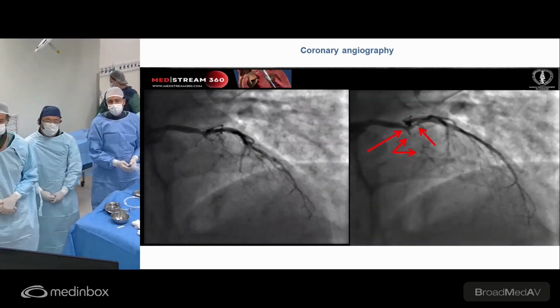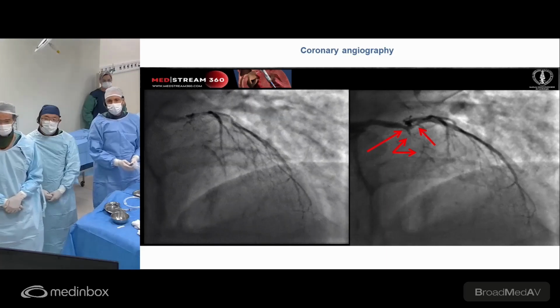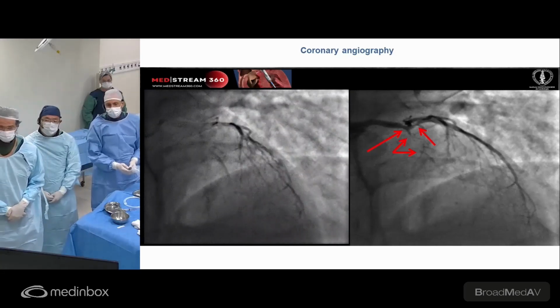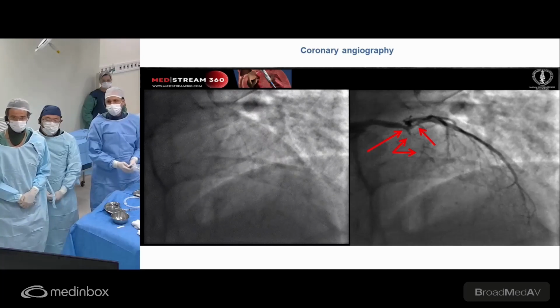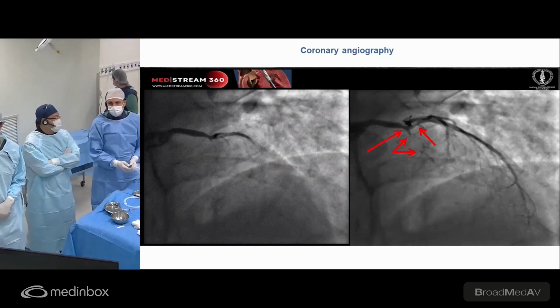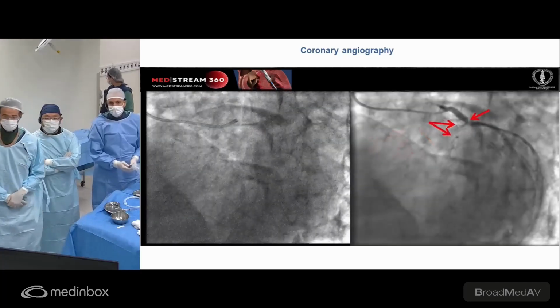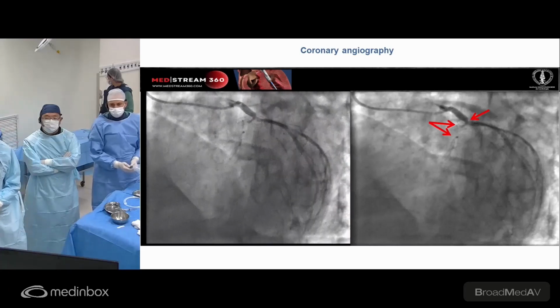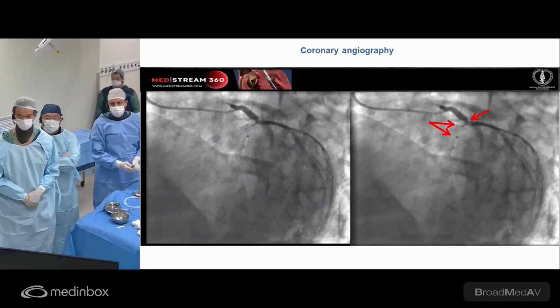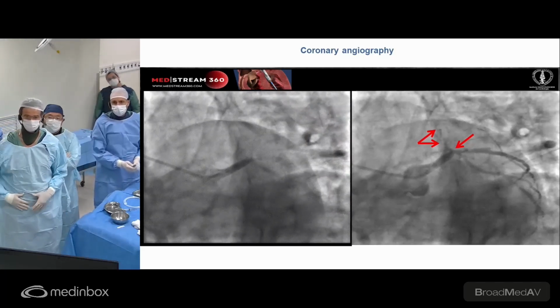If we move here to the cranial view, it's more clear to see the distal portion of the LAD with collaterals here, and the occlusion itself doesn't appear to be that long, but what also calls the attention more is the significant lesion in the distal portion of the left main, really involving this trifurcation. We also don't see angiographically significant calcification there. Now, in the LAO cranial view, we see again the LAD and the collaterals here, with a very proximal occlusion. And in the spider view, we can see the trifurcation better.